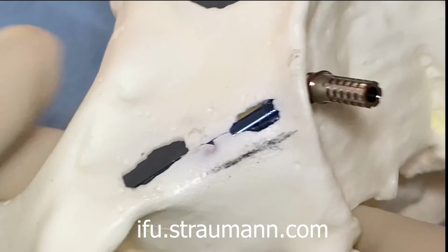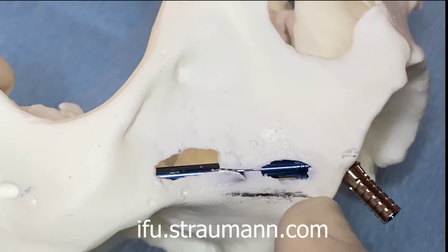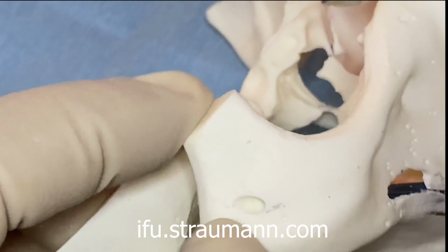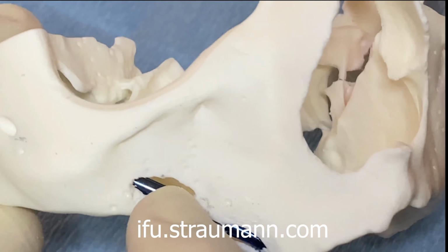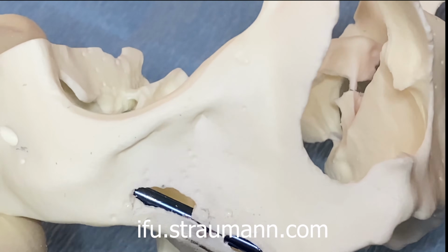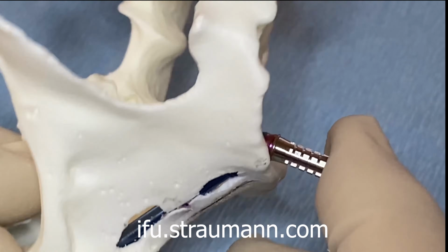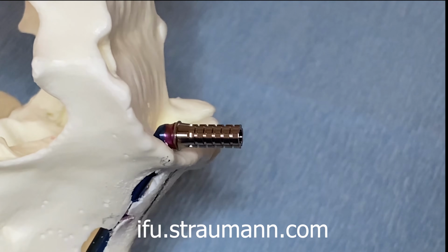I hope this was a helpful exercise. We placed our implant. We started from the second bicuspid first molar. We paralleled the black dotted line. We exited at the front of the zygomatic notch. We are butt up against the lateral maxillary wall, so we know we're away from vital structures such as the orbit. We have our SRA abutment in place, and we have our temporary titanium cylinder if we're going to immediate load and convert this patient.